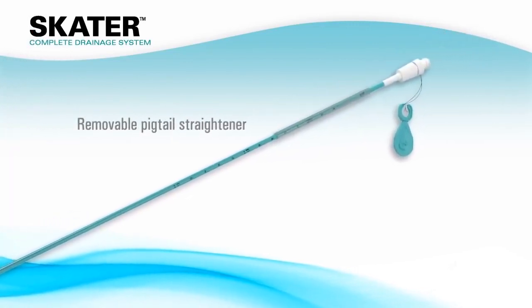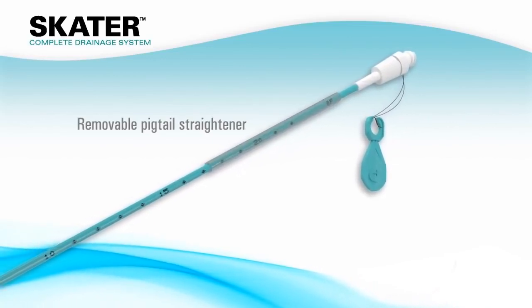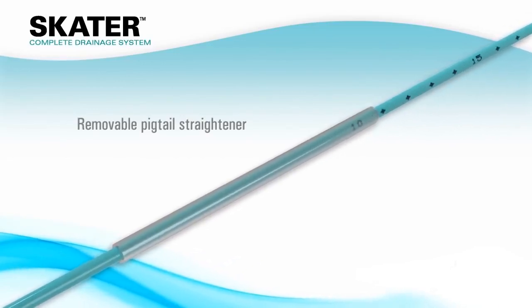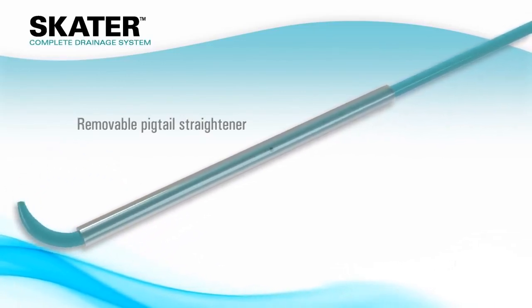The removable pigtail straightener is designed to straighten the pigtail shape and ease loading of the stiffening cannula and or trocar to prepare the catheter prior to insertion.